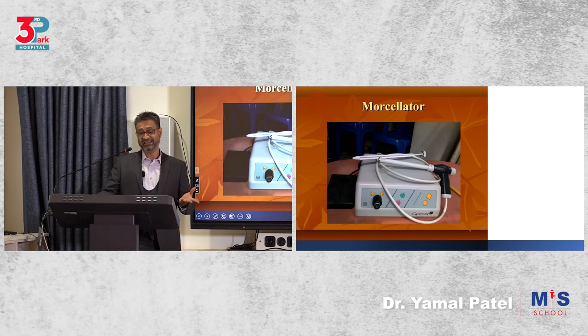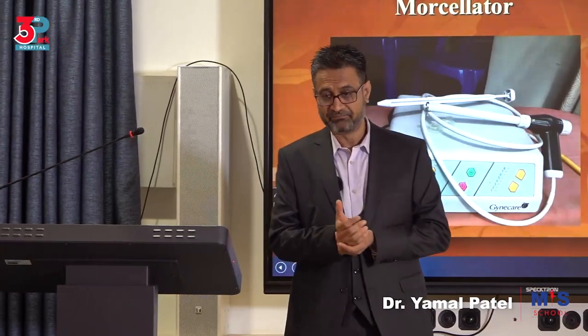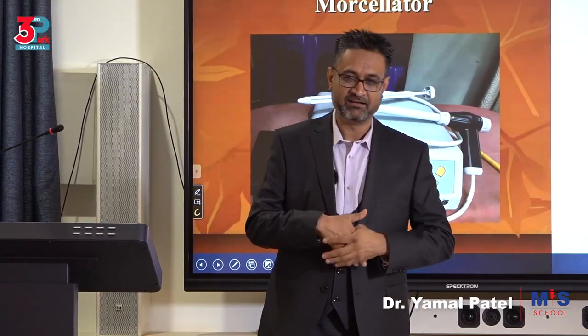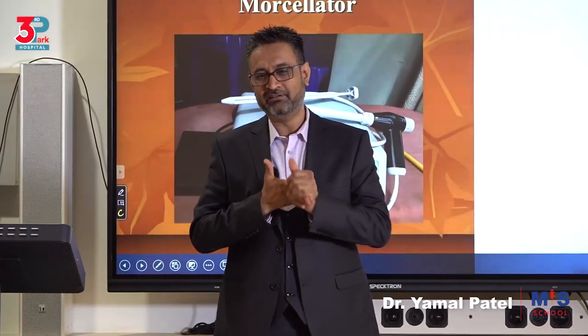We have the morcellator. I know there have been issues about morcellation, and it's been under caution. I wouldn't say banned. It's been under caution. It could be banned in the US. It's not banned here. I have done over 1,500 laparoscopic myomectomies. I've not come across one sarcoma.